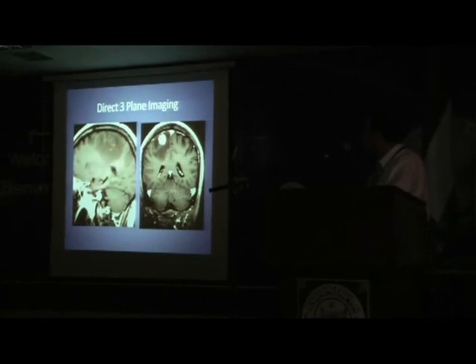This is a patient with a tumor, an intraaxial tumor, a GBM, with surrounding edema. This is pre-contrast and this is after contrast. You could see the enhancement.